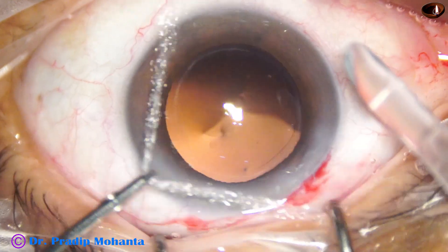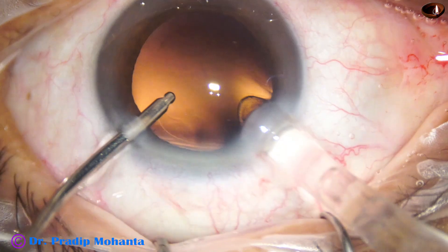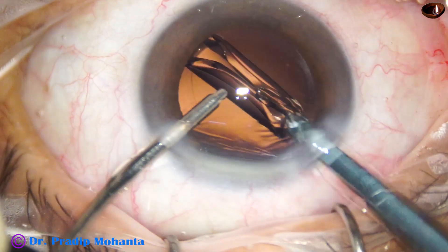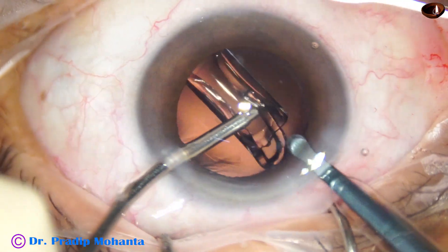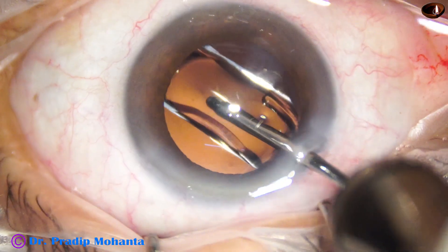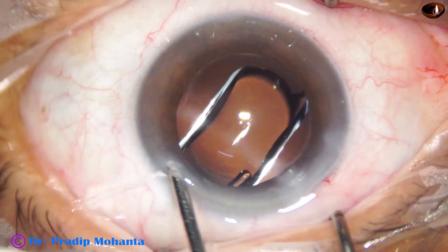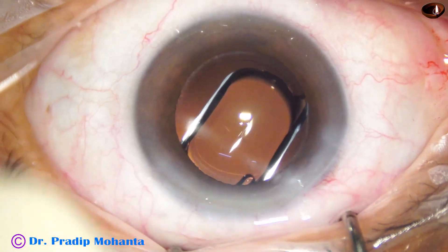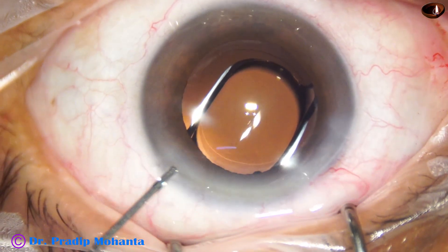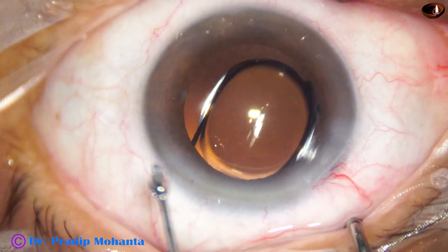This is the intraocular lens — see the leading haptic. This is the way to bend it, otherwise it can cause stress on the posterior capsule and sometimes even tear the posterior capsule. This technique is from Johnson and Johnson — very thick optics, very thick haptics.